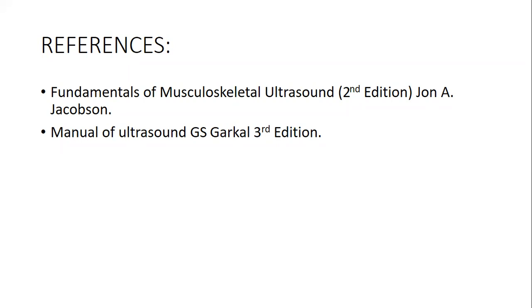This may have been compromised either by a POP or an injury that healed, and the patient may not open the elbow. Also, don't work as an individual. Rehearse with the physiotherapy department. But as a sonographer, emphasize the lateral portion so much because this is where you have the common extensor tendon, and it has other components that you need to understand as a complexity.